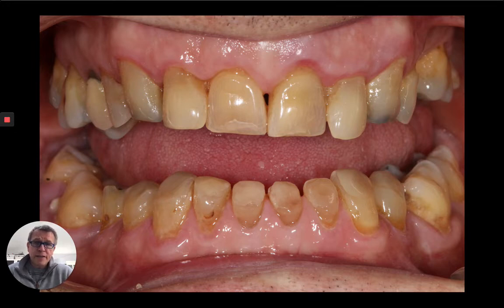I think the teeth are really quite worn down. Smile, we can definitely improve upon it. Ray certainly wants a degree of improvement, although he doesn't want to have the Simon Cowell effect, or so he told me. So we're looking to see what that would be. Ray's airway appears to be in good shape. We know that from the history, and also we do a very, very simple sleep test, just to make sure everything's okay with him, and he certainly was. So this is more of a traditional tooth-based solution that we're looking for here.